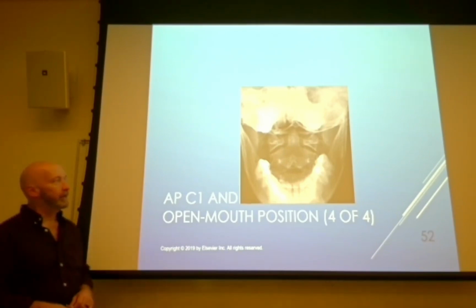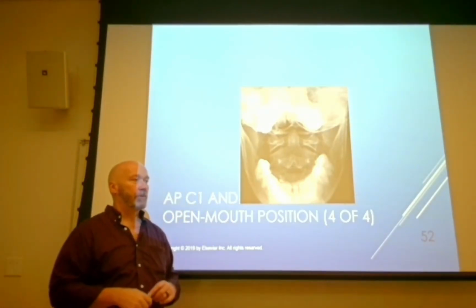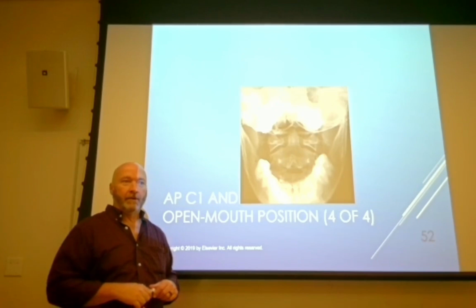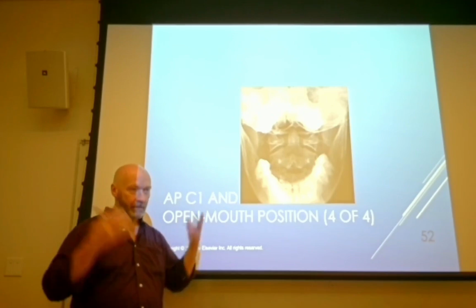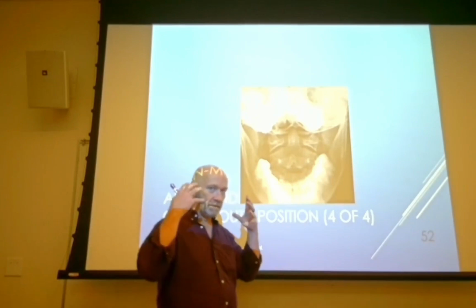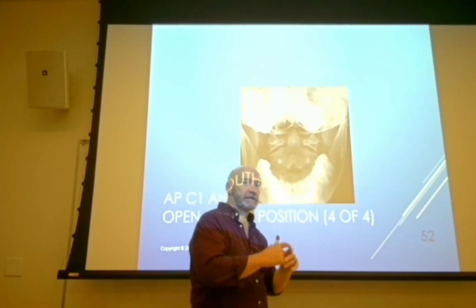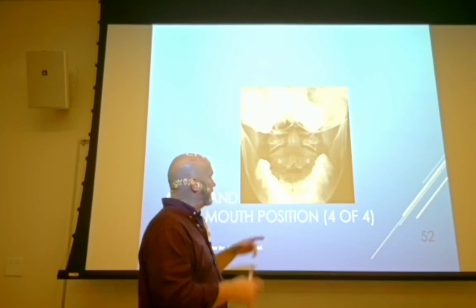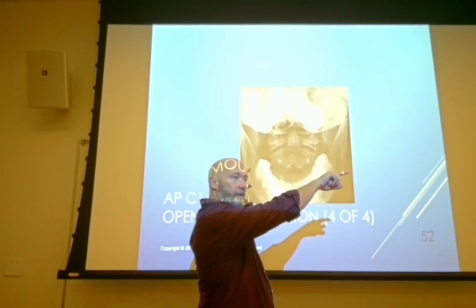Specifically, what we're looking for is if the patient has fallen and landed on top of their head, we can have what we refer to as an axial loading fracture. Or if somebody's working on a construction site and a big brick falls on top of their head, they're wearing a hard hat, so they're going to be okay. But because suddenly they've got this traumatic weight dropped on top of their head, the ring of C1 can fracture. And what we're specifically looking for in that case would be that the lateral masses of C1 would be pushed out a little bit.